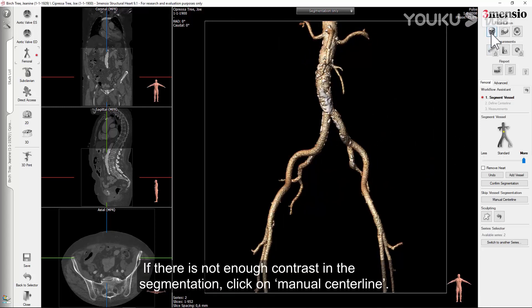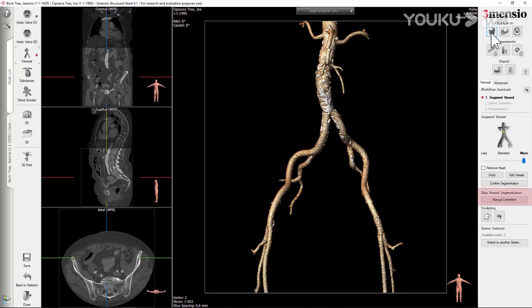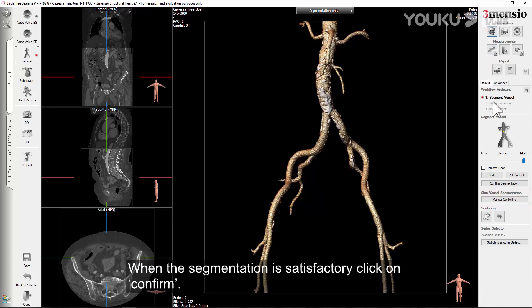If there is not enough contrast in the segmentation, click on Manual Centerline. When the segmentation is satisfactory, click on Confirm.